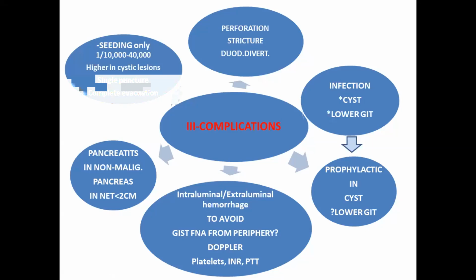translocation of malignant cells, higher in cystic lesions. In cystic lesions, try to do a single puncture and do complete evacuation of the cyst to decrease the pressure inside, to prevent oozing of some fluid into the nearby tissue, to minimize seeding.